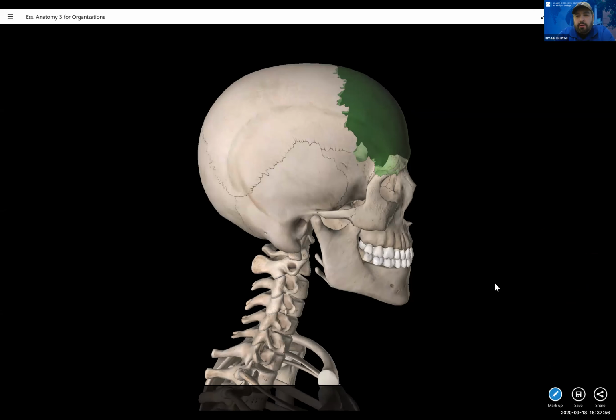So here is your OML. There's your OML. I really can't rotate it down, so we're going to pretend like the IOML is perpendicular. Well, it's not really going to show you. But anyway, if our CR is angled this way, we still want to maintain a 30-degree angle between the OML and the CR. That's going to give us the perfect projection. Anytime you have less than 30-degree angle, then you're going to get that dorsum sellae projected above the foramen magnum. Two things can happen.